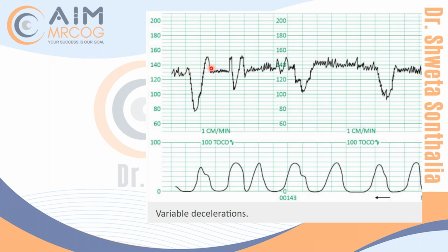Here, if you take it as shouldering, you cannot, because shouldering should come and then it should come down, not like this. So this is not shouldering, it's a rise in the baseline. Here there is no shouldering, no shouldering here, and here it was looking like a W shape. Here also no shouldering, right? Yeah, so it's V shape and getting worse.